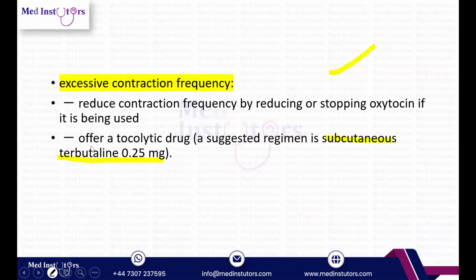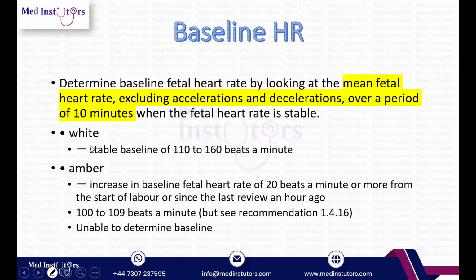Next we'll talk about the baseline heart rate. To determine the baseline heart rate, you have to look at the mean fetal heart rate, excluding the accelerations and decelerations, that is the upward flick and the downward flick, over a period of 10 minutes. It's an average heart rate.